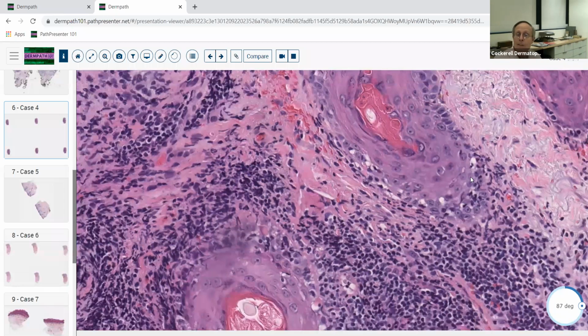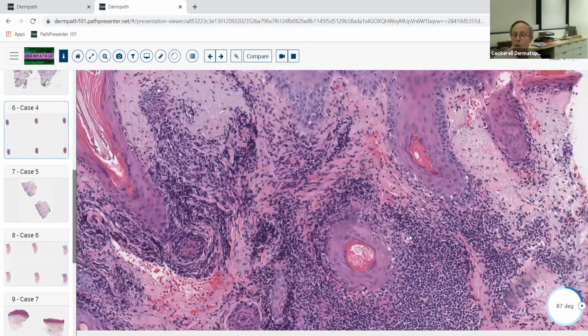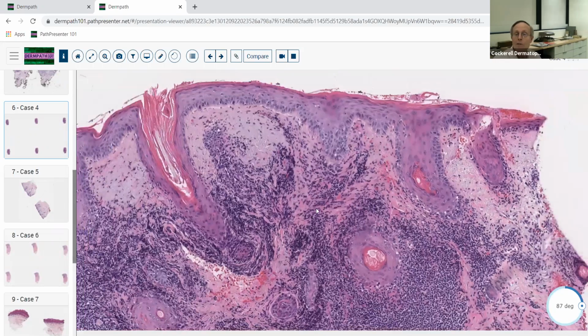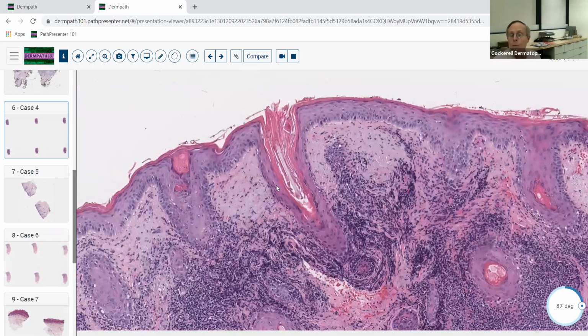And they may not have this density of the infiltrate that we see in the dermis here in this person that's got this chronic discoid LE. And you don't see follicular plugging in acute or even subacute lupus for that matter. So if you look at the biopsy of SCLE and acute LE, they're mostly just vacuolar alteration with a usually relatively sparse infiltrate of lymphocytes. And that can look quite a bit like dermatomyositis, which we're going to look at in a minute.